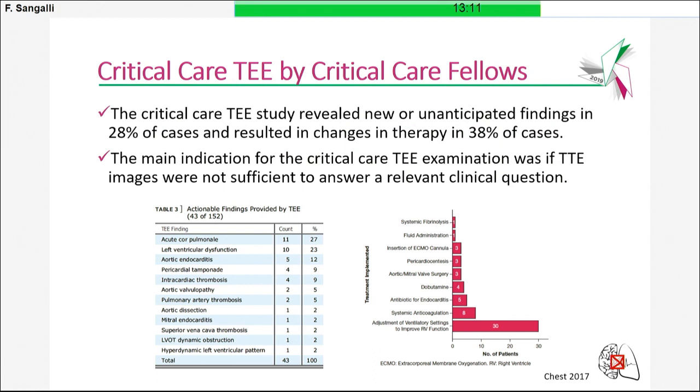What is becoming more and more evident is that you don't need an extremely complex or advanced training for basic TOE. There are many papers published in the past 5 or 6 years regarding training in basic TOE. And this one was one of the last that I saw. It was done on critical care fellows with a basic training in TOE. And in 1 patient in 3, roughly, the critical care fellows-led examination led to a new or unexpected finding, and in the majority of patients, this led in turn to a modification of management.